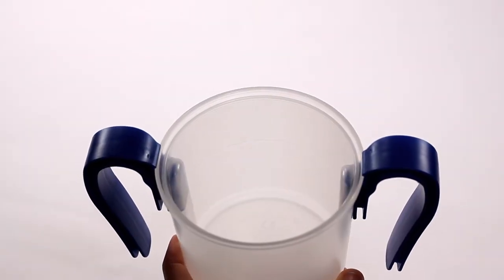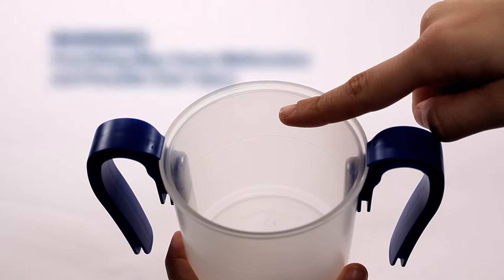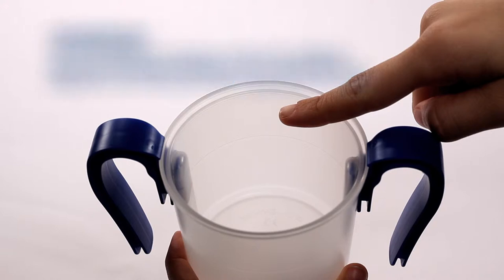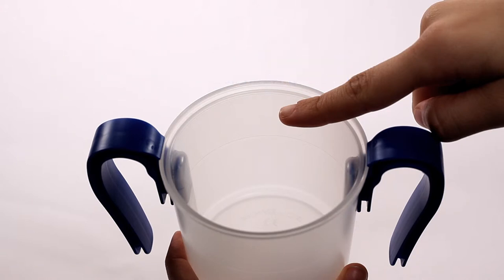Notice the eight-ounce fill line molded on the inside of the outer cup. The cup is designed to be filled with up to eight ounces of thin liquid. Overfilling above eight ounces could cause the cup to malfunction, resulting in patient injury. Also avoid putting liquids in the cup which may be too hot and risk injuring the user.